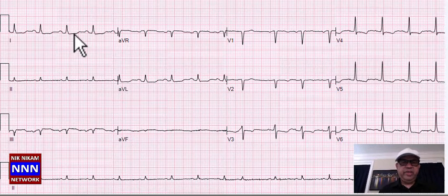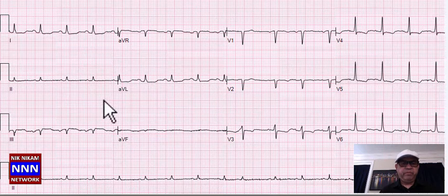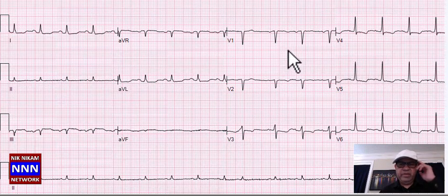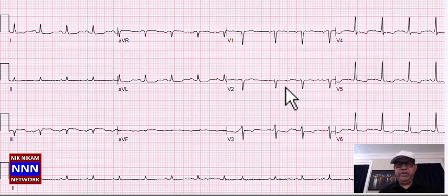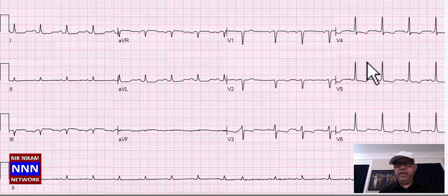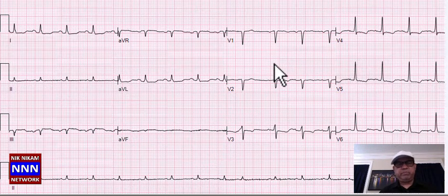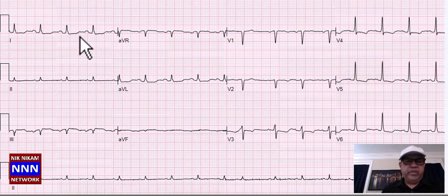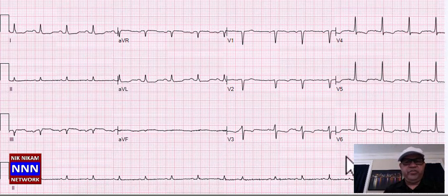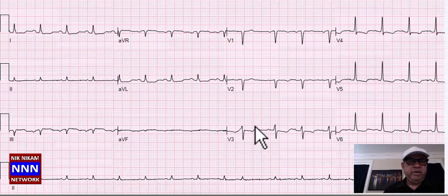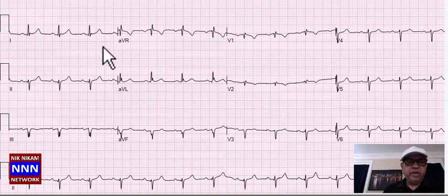We have sinus rhythm with low voltage in the limb leads. Flat T-waves laterally. In the anterior leads, QS complexes in V1 and V2, T-wave inversion, and in the lateral leads T-wave inversion with ST depression. This is an abnormal EKG — normal sinus rhythm, low voltage in limb leads, possible old anteroseptal myocardial infarction with ST-T changes suggestive of ischemia.